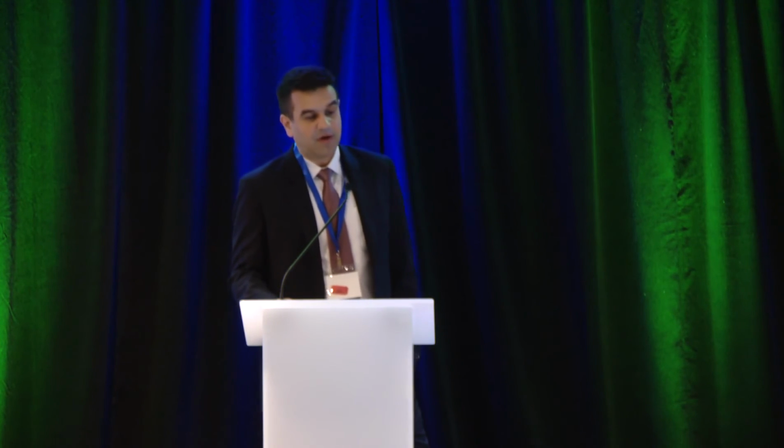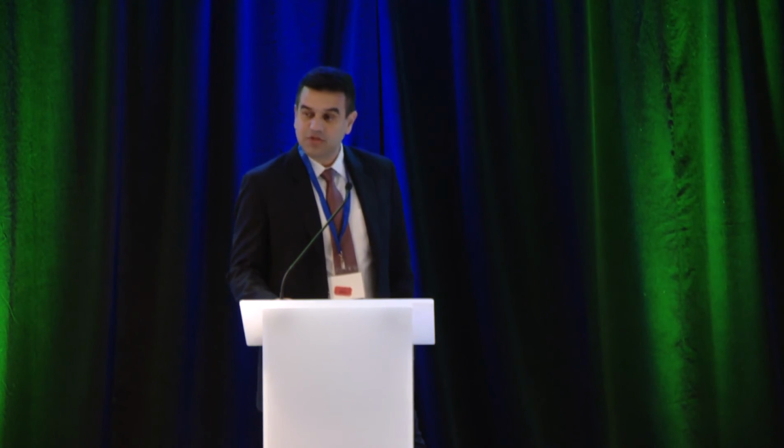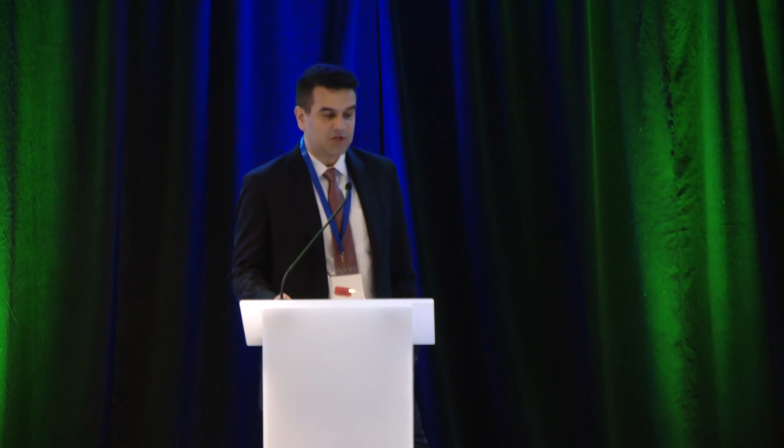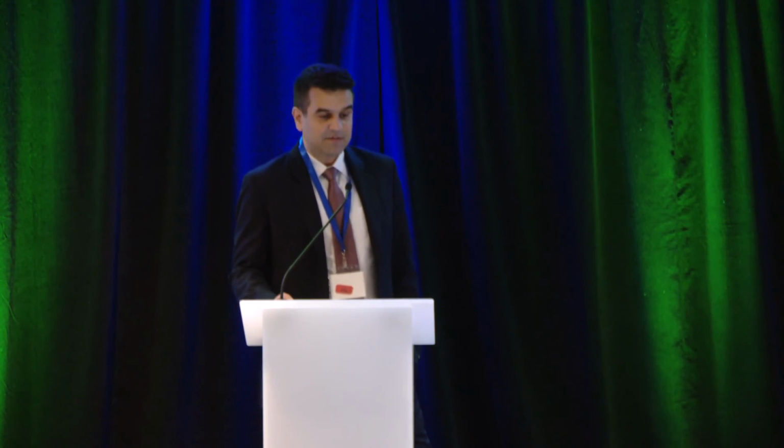These are images from the technical review of Chicago 4.0, representative of type 1, 2, and 3 achalasia swallows. In type 1, you have 100% failed peristalsis without panesophageal pressurization. Typically, it appears like that on the bottom left, a lot of the swallows. In type 2, you start having panesophageal pressurization above a specific millimeters of mercury in at least 20% of your swallows.